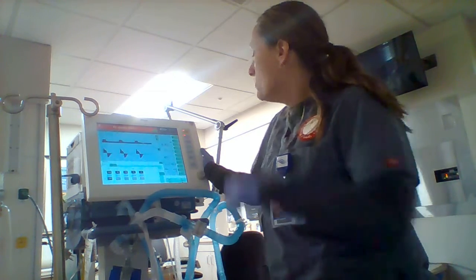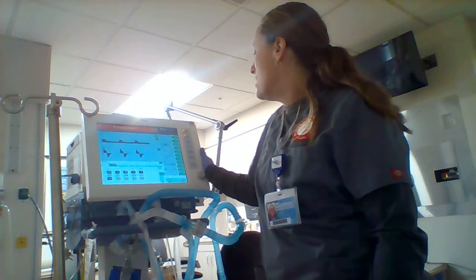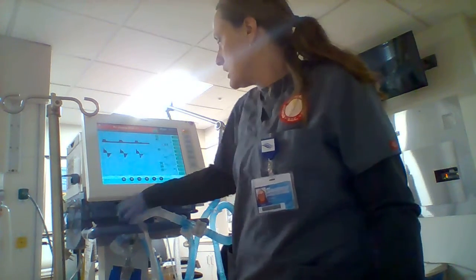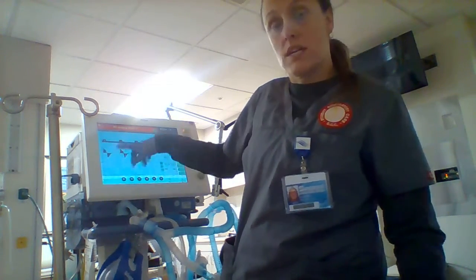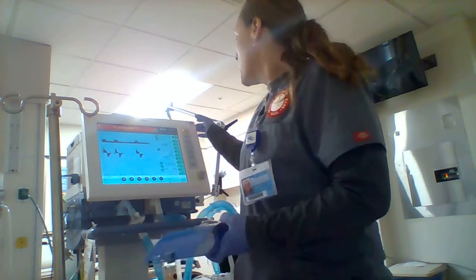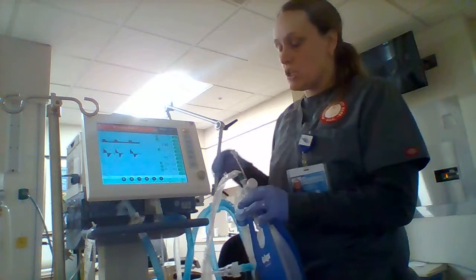Liters per minute. My minute ventilation is almost 6. My peak inspiratory pressure is 21. That's not bad. Perfect. So pressure's a little high. I think at some point we're going to cover what these little squiggly things mean down here. They've tried to explain it to me here, and I have no idea what it means. Apparently, bird beaks are bad. That's all I know.